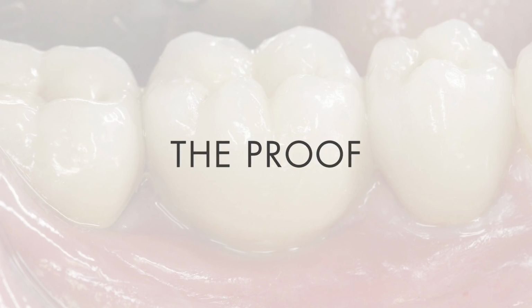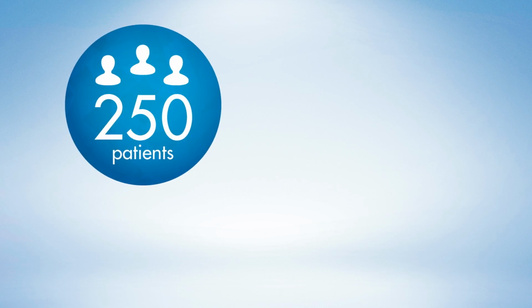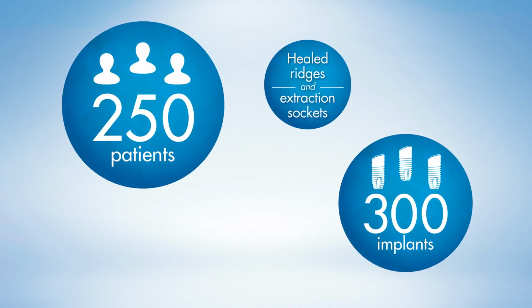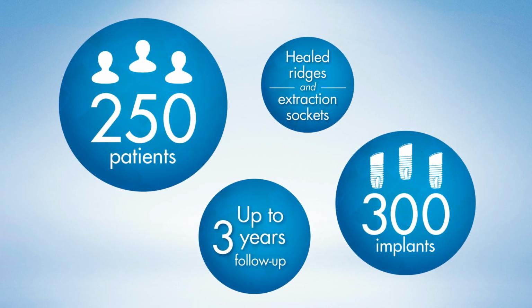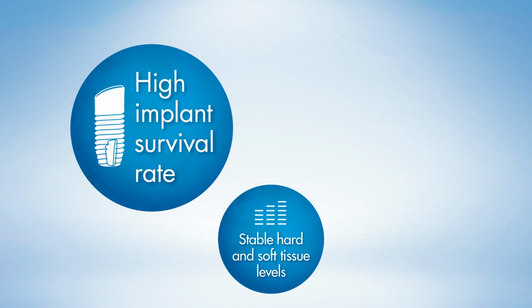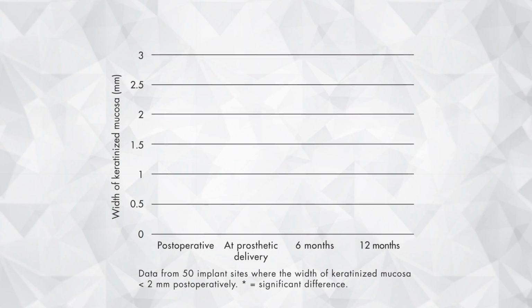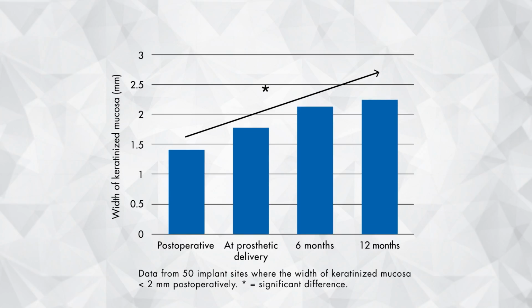OsseoSpeed Profile implants are being evaluated in several ongoing studies, with 250 patients and 300 implants, including healed ridges and extraction sockets with up to 3 years follow-up. The main conclusions have been high implant survival rate, stable hard and soft tissue levels, preserved buccal and lingual bone levels. A significant increase in the width of keratinized mucosa in patients with compromised soft tissue has also been reported.